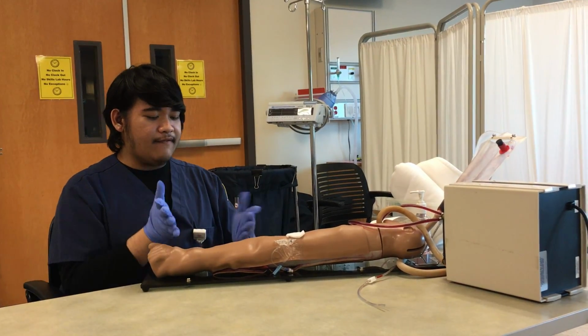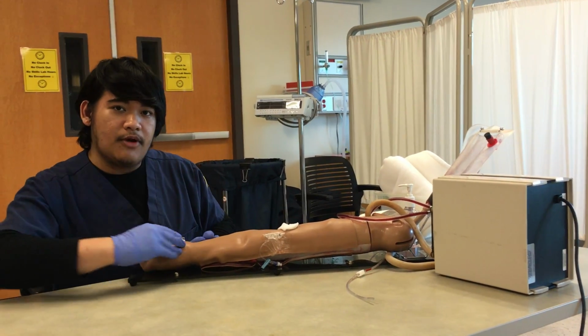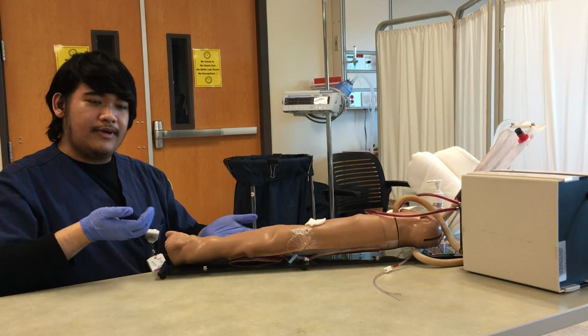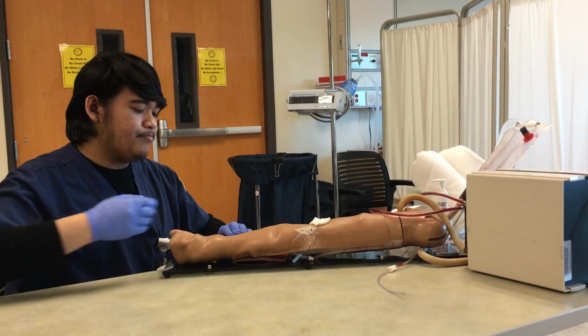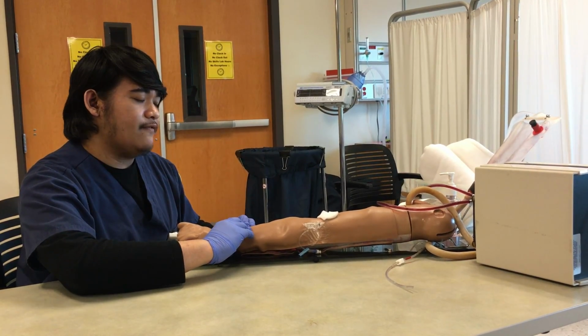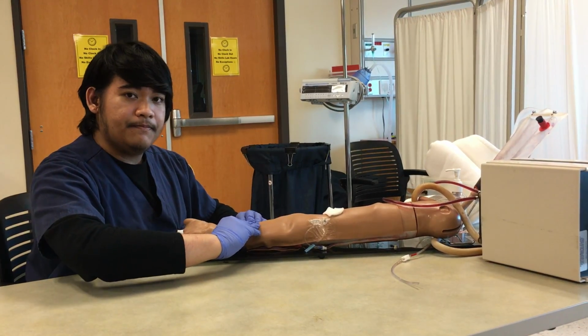Once I know where I'm going to do my puncture, I'm going to do the modified Allen's test. How we do it is we occlude the radial and the ulnar artery, and we ask the patient to pump his or her fist while we occlude them.